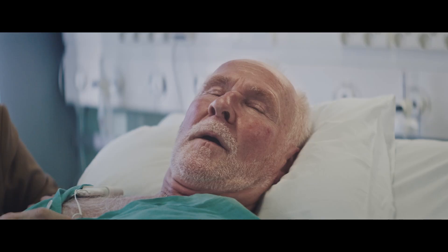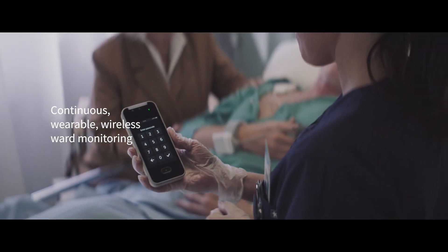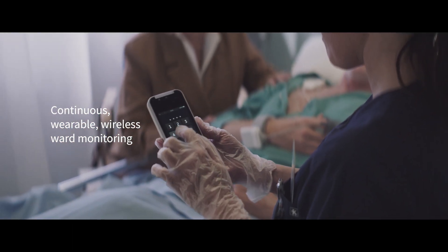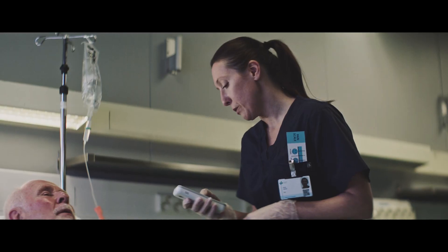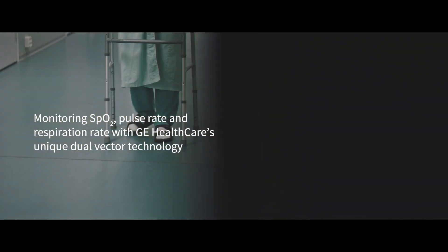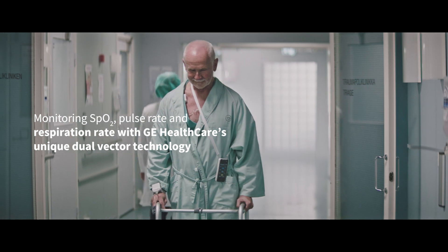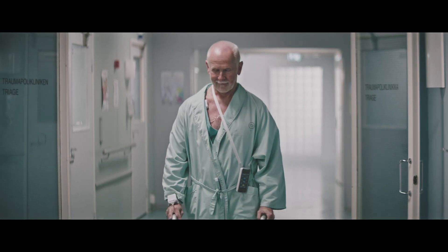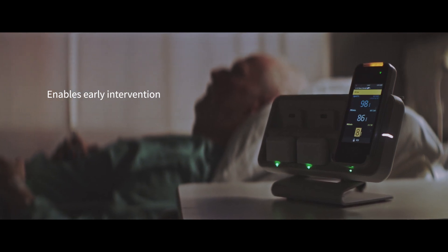Portrait Mobile is a continuous, wearable, wireless monitoring solution that provides a real-time picture of the patient's health. The solution goes wherever the patient goes in the hospital, while continuously monitoring SpO2, pulse rate, and respiration rate, utilizing GE's unique dual-vector technology. Because the flow of data is uninterrupted and provides continuous trending and meaningful alarms, clinicians can detect deterioration as it is happening and intervene proactively.